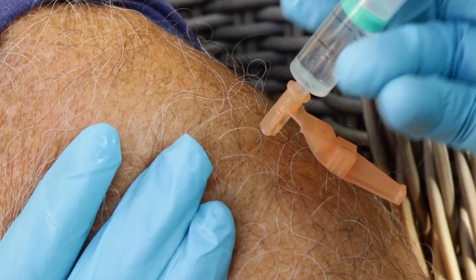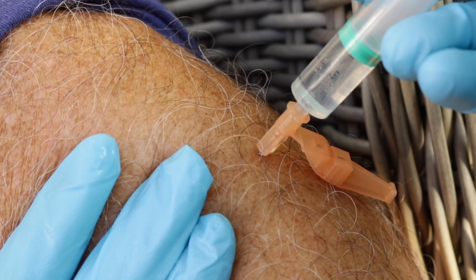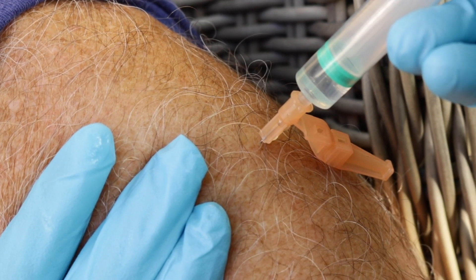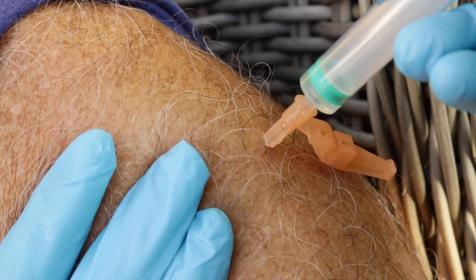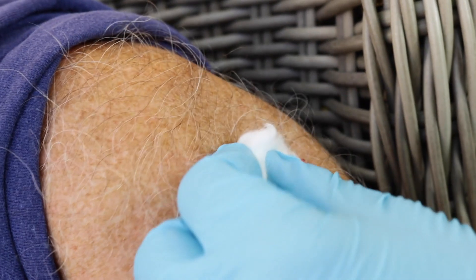Hold the skin there while inserting the needle into the muscle at a 90 degree angle. Then push down the plunger to inject the medication slowly into the patient's muscle. Wait several seconds before withdrawing the needle to allow the medication to disperse, then pull out the needle keeping it at that 90 degree angle.